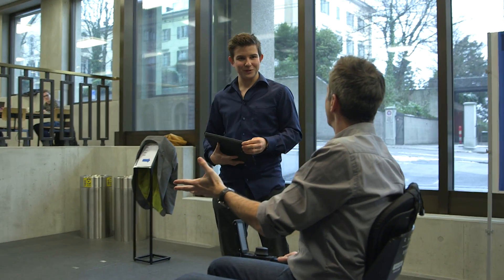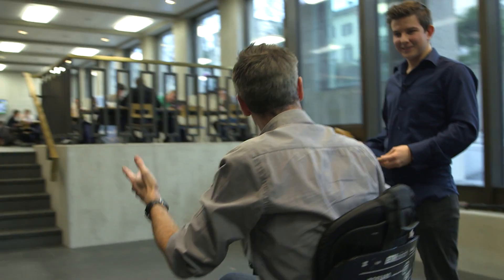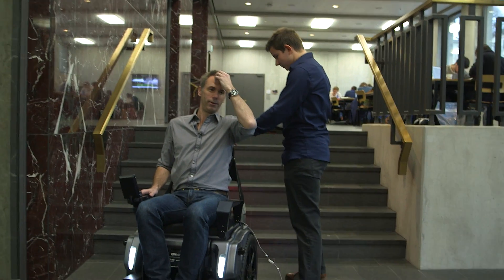Shall we try climbing stairs? Sure. We're going to climb some stairs in a wheelchair now. So I'm just going to go this way. This is the bit where I start to get a bit nervous.